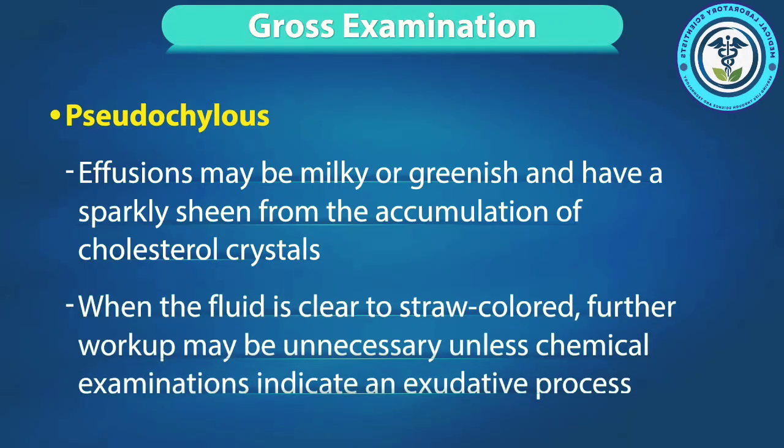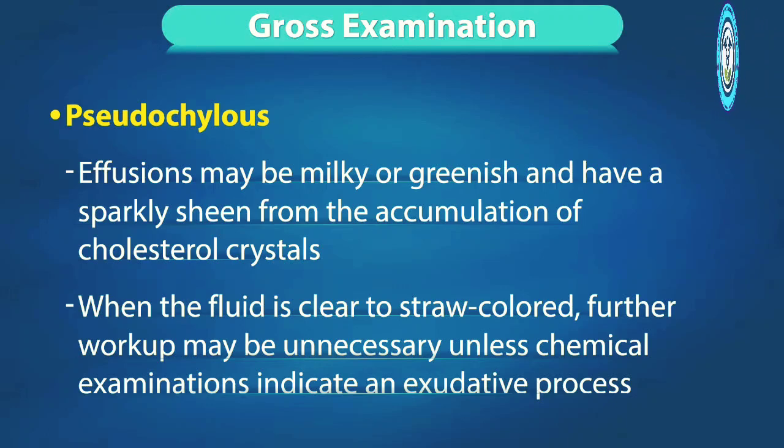Conversely, when the fluid is clear to straw colored, further workup may be unnecessary unless chemical examination indicates an exudative process.